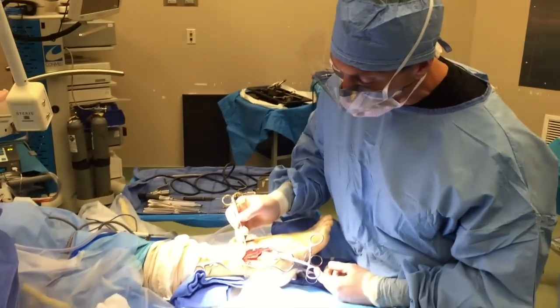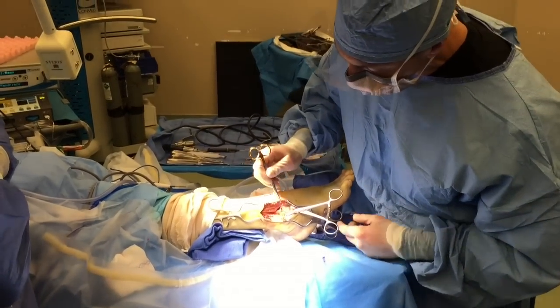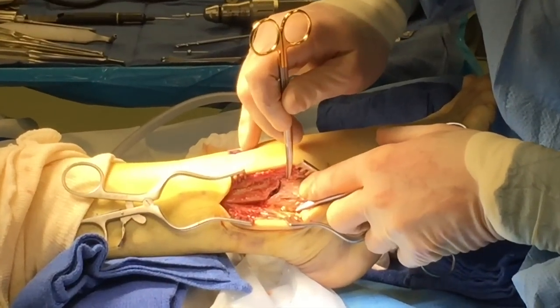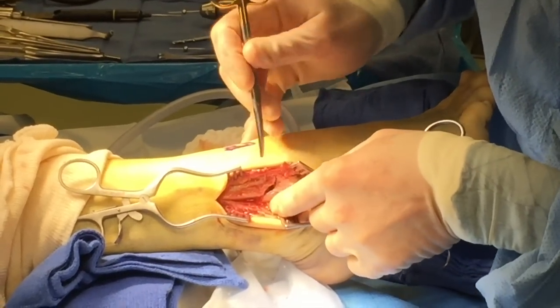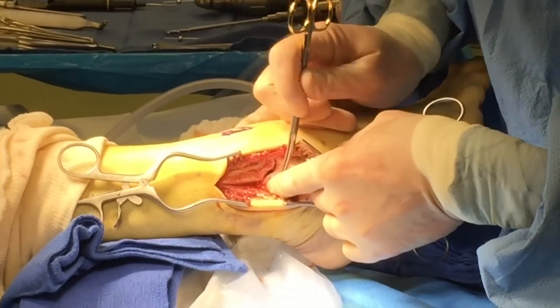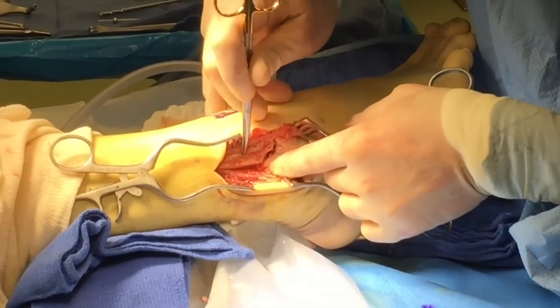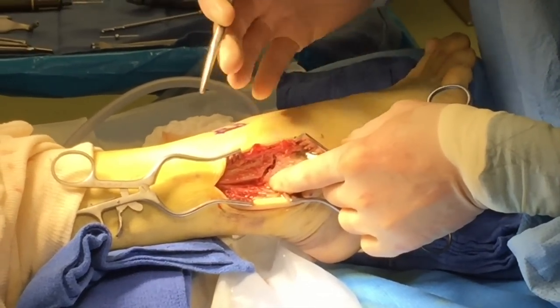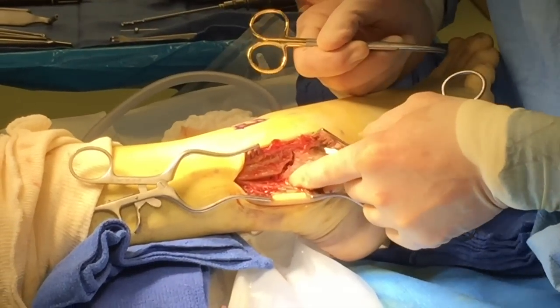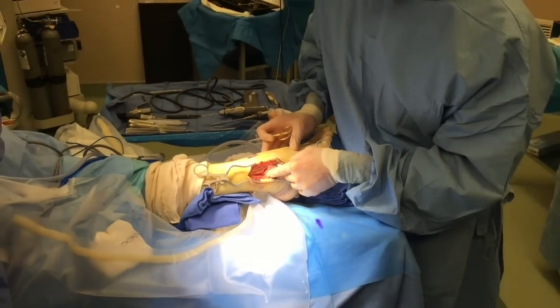Here's the fibular fracture — this is the proximal fibula, this is the end of the malleolus. You can see the fragments have been cleaned out and the dissection has been done. We're going to distract the distal fibula down, move it forward and compress it upwards with a lag screw, and then put the plate on the outside. On x-ray, the fibula is a little bit kicked outwards, so we're going to bend the plate to pull it back down so it presses into the talus and closes down the gap in this lateral gutter.